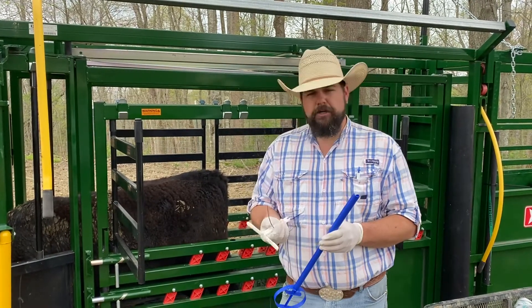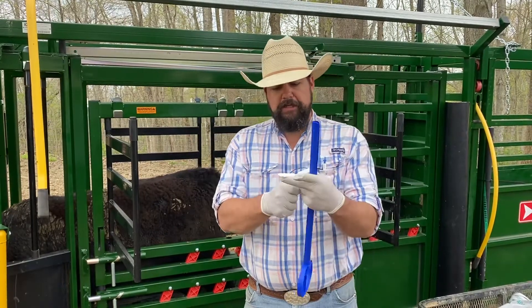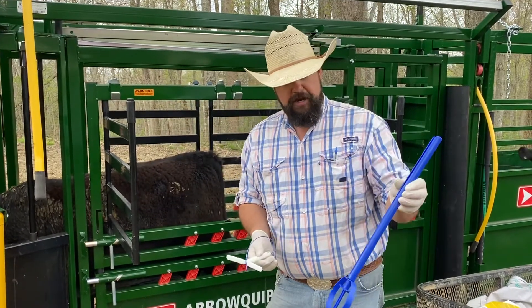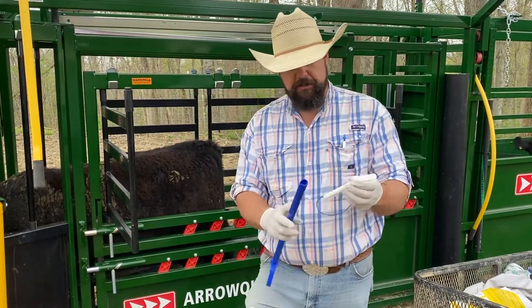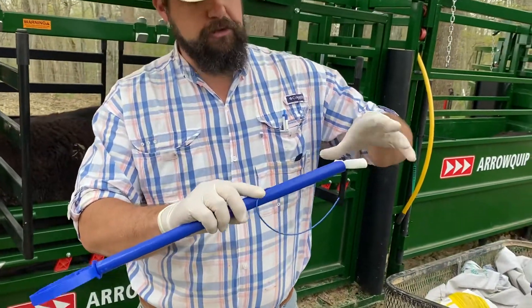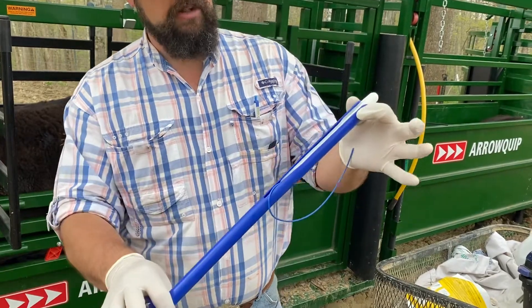I'm going to show you how to insert a CIDR today. This is the CIDR here in my right hand. These wings are actually going to fold up whenever I insert it — they flop back out and hold the CIDR in there. This is a CIDR applicator device. To load this up, I'm just going to slide this down in here like this. I always try to make sure the tail's down — we'll talk about that in just a second. So just fold those wings up and put it in there like that.